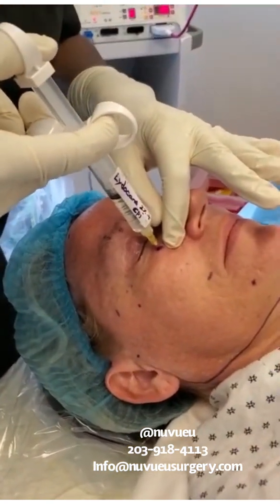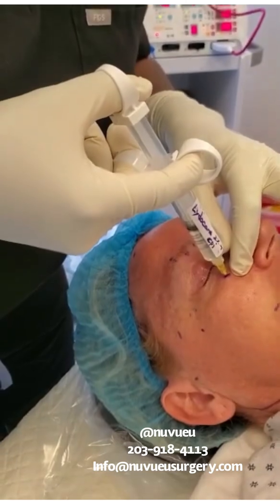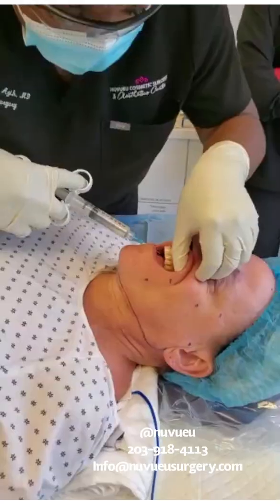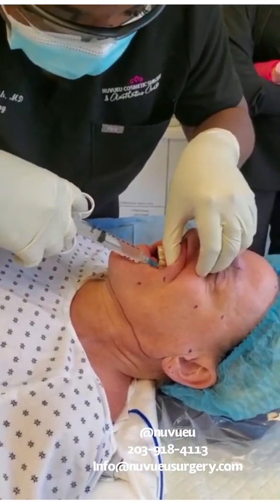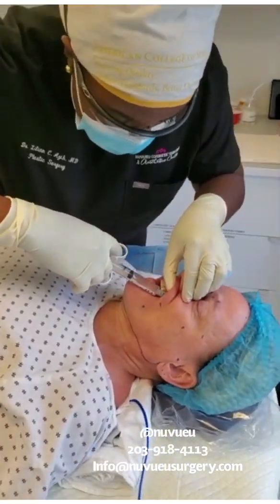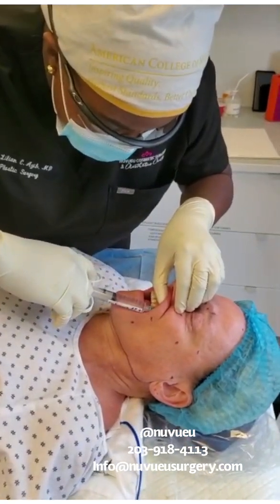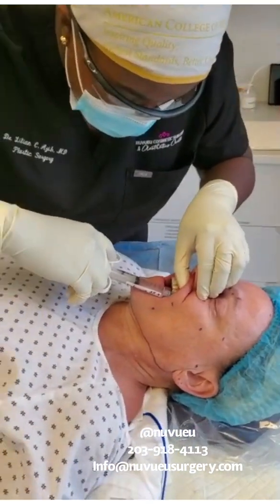And go slow. What's the definition of aspirate? It's when you pull back at all times. So we're doing the transcutaneous approach. I'm right in the fossa, so I'm going to aspirate to make sure I'm not in a vessel, and in that direction I'm going to go ahead and put my finger right there to make sure.